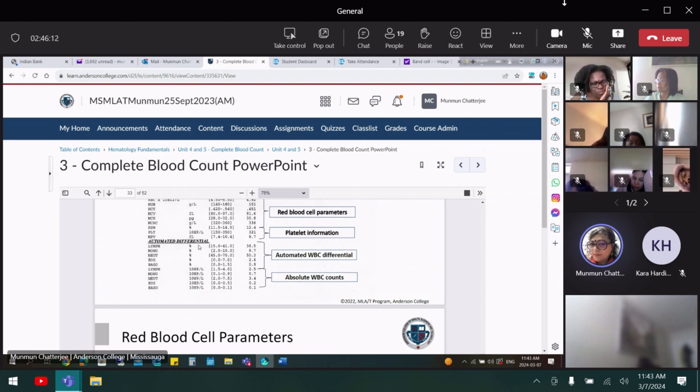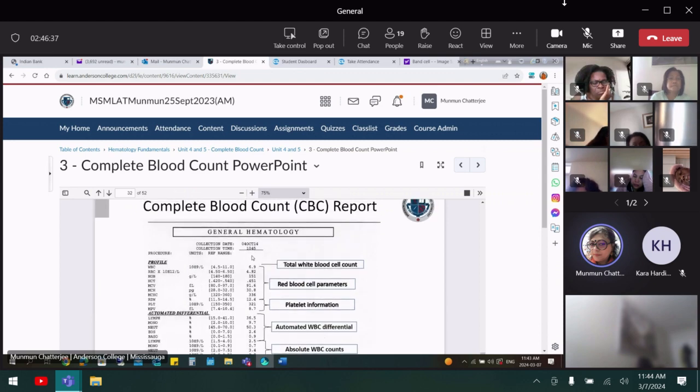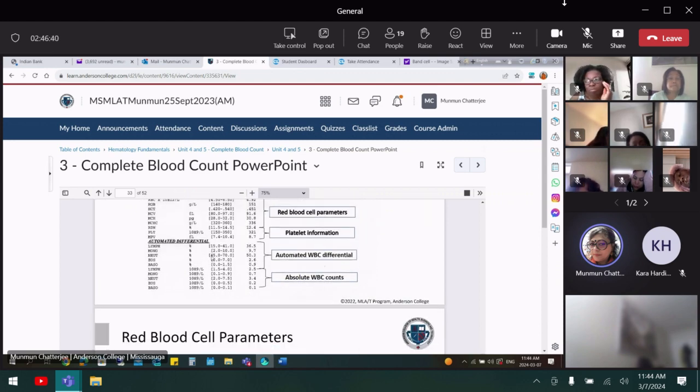Again, they are going to give the same thing in terms of percentage and also in terms of per liter. So some of them use the percentage. What is the percentage of the lymphocytes present? Neutrophil is the highest number. The general reference is 50, and the range is 45 to 70. So it is giving you the exact value, which is good, but this is the range.